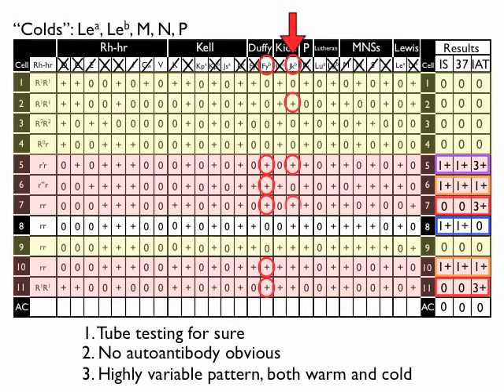Let's look at JKB on the other hand. Obviously, you've got that straggler sitting up there in cell 2. Yeah, but dosage, you maybe could ignore that. But what you can't ignore is looking down in cells 10 or 11, and you can see why JKB does not fit as the warm specificity.